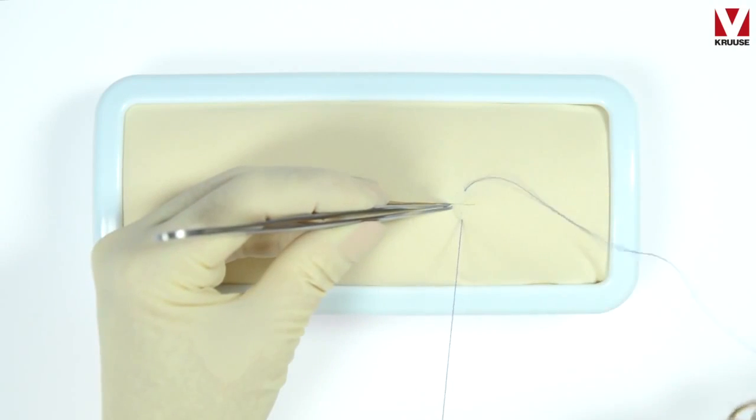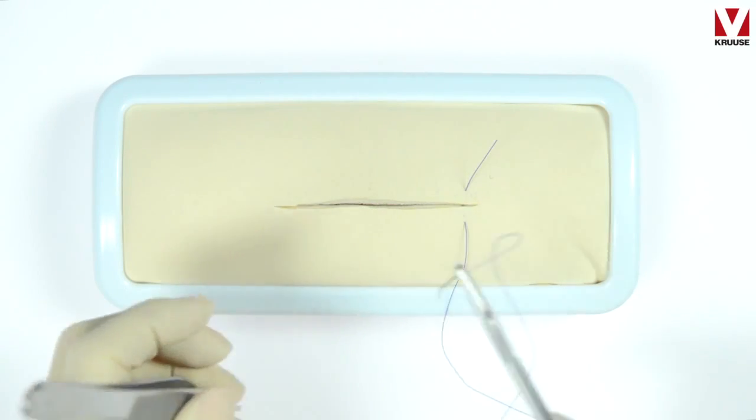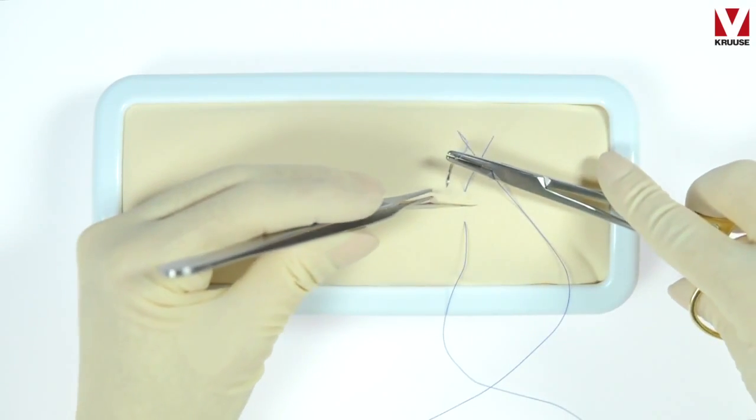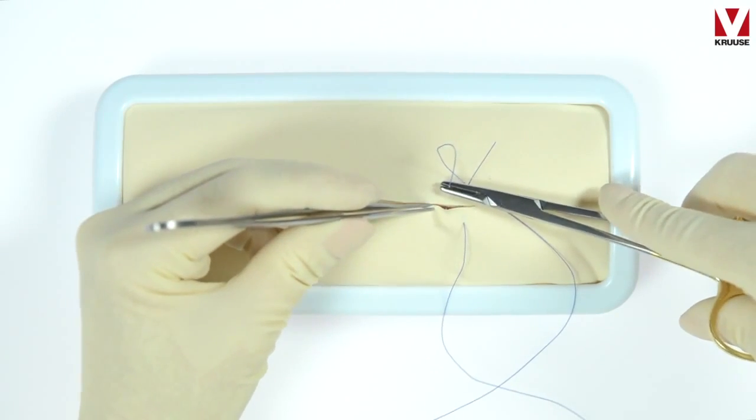Start far from the incision and then go near to yourself on the opposite side of the incision, then repeat that. So this is far, near, and then far, near again.